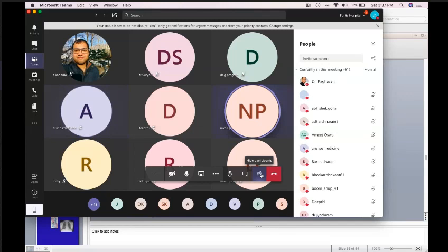Sir, one more thing, like indications of views in ASD, VSD, PDA and all those views. Can we have indications, like for MR, the good view, like you showed, sir, is the RAO view, where you can assess the MR, where you can see the LA, LV and LVOT. So like that, the different views where we are using them, can we have a short session on that?